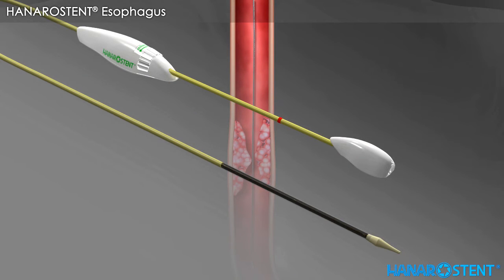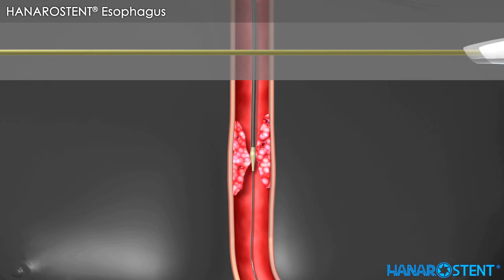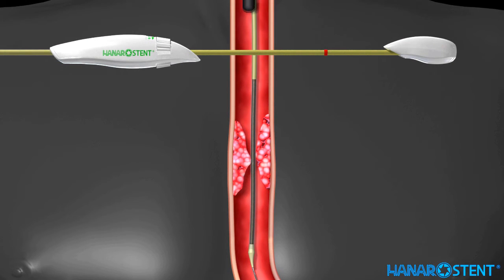Now, take the delivery device out of package. Inject saline solution into the hole of delivery device to make sure that inner path of the delivery device is smooth and clear. Advance delivery device along the guide wire. Advance endoscope. Remember that the red marker indicates the point of no return. Check the location of olive tip.